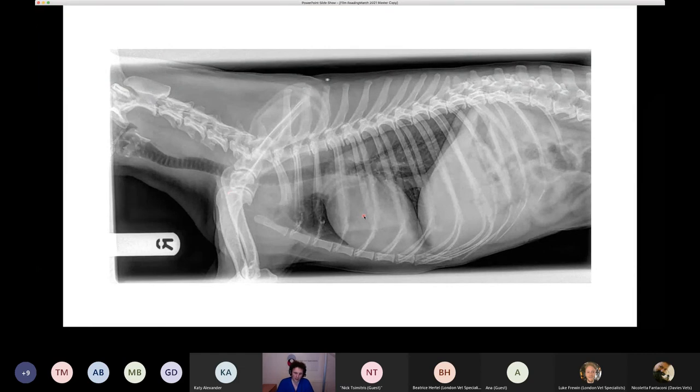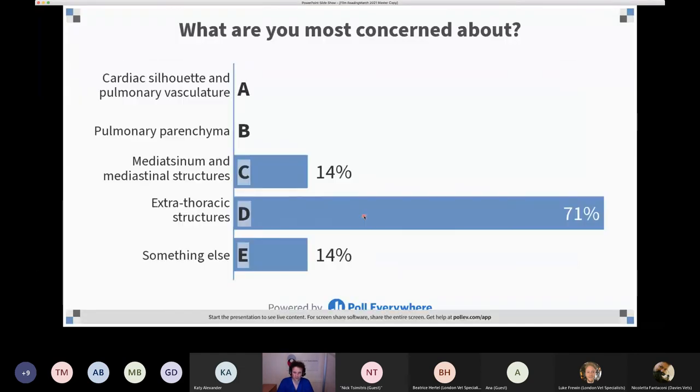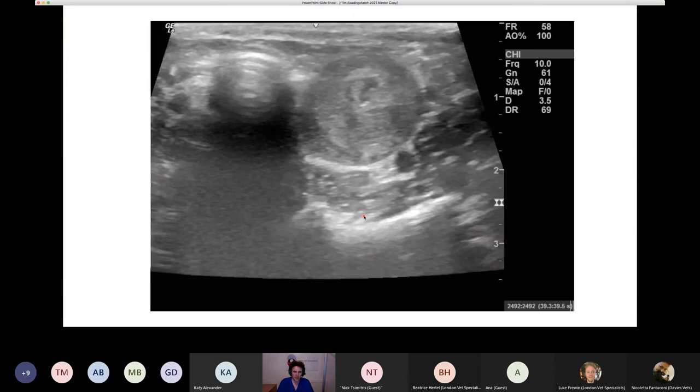So for this dog, we didn't do a CT. What we did do was an ultrasound, which gives me the opportunity to talk a little bit about ultrasound of the neck and how you can go about finding thyroid glands. So this is an ultrasound image taken from this patient. And just so you guys can orient yourself, the patient is pretty much lying on his back, and I've got the probe. It's a linear probe I'm using here. So it's a high frequency, 15 megahertz linear probe.